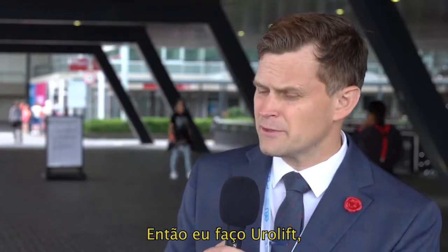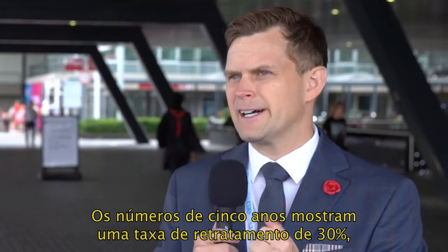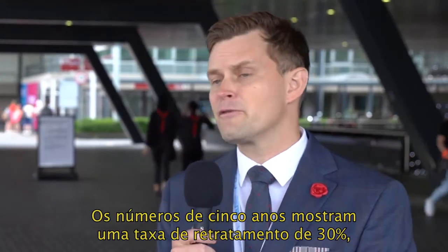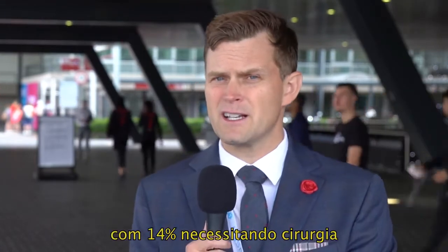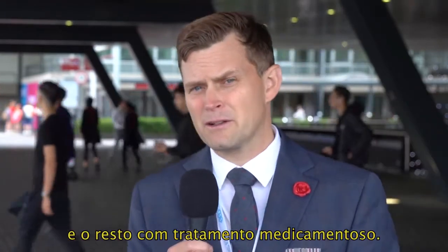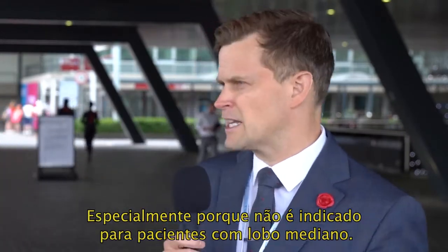So I've done UroLift, it requires a bit more anesthesia, and we know the retreatment rates seem to be higher. Counseling on patients of 5-year data is about 30% patients will need to be retreated, be it surgically, on 14%, and the rest on medical therapy. So given that cost, not many people are doing the UroLift, especially it's not indicated for median lobes.